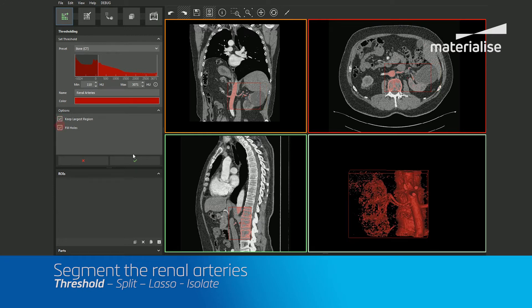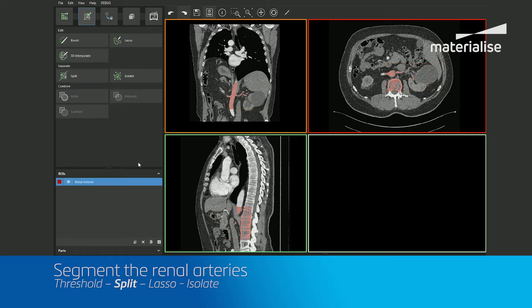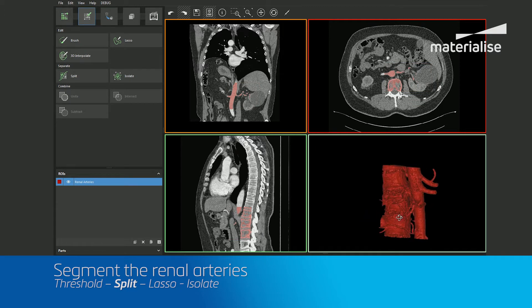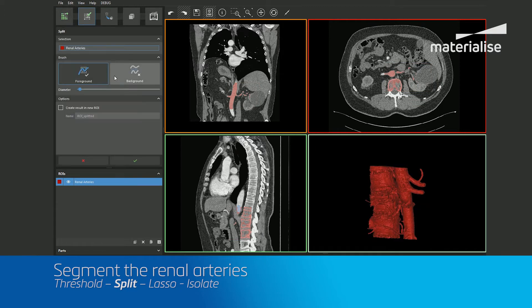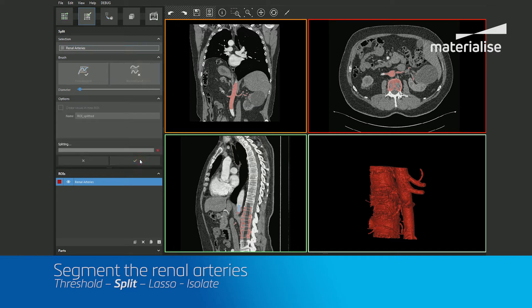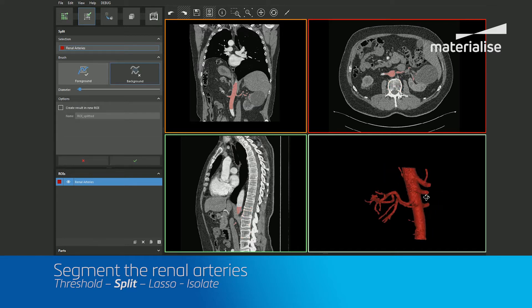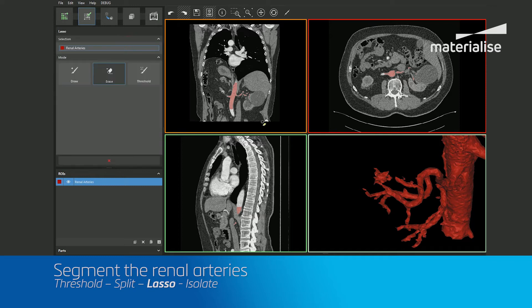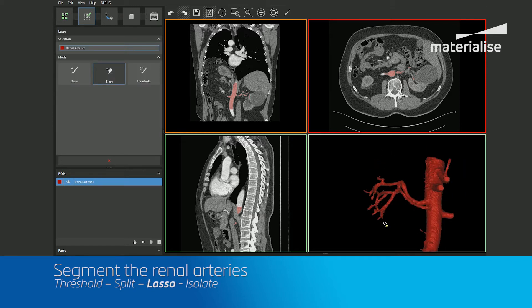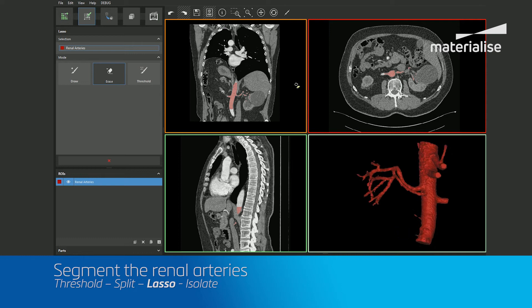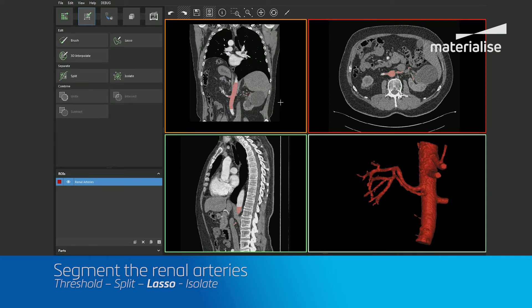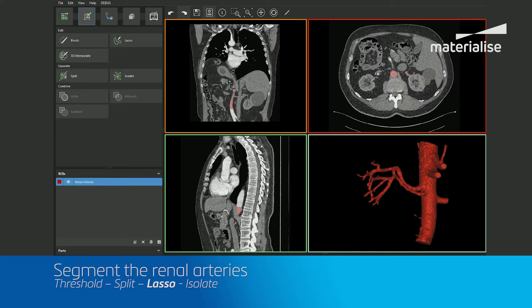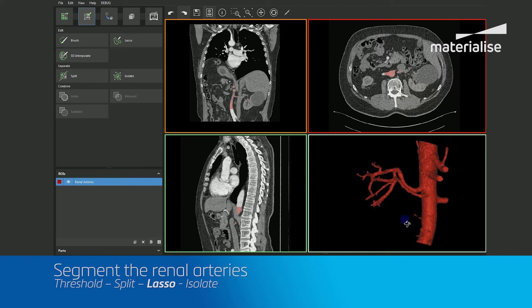You'll notice the spine is still attached to the aorta. To remove this, we will use the split mask tool to mark the aorta in the foreground and the spine in the background. If you have unwanted areas still remaining, we can quickly erase them using the lasso tool in 3D. As a last step in the segmentation process, we can perform an isolate operation to ensure that we remove any noise artifacts or extra shells from our model.